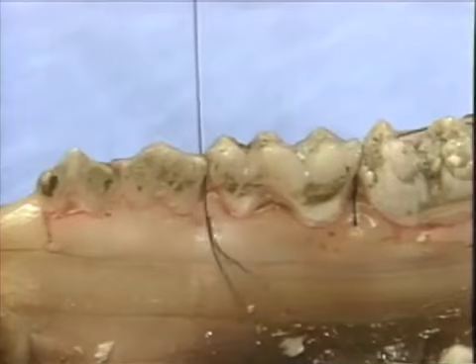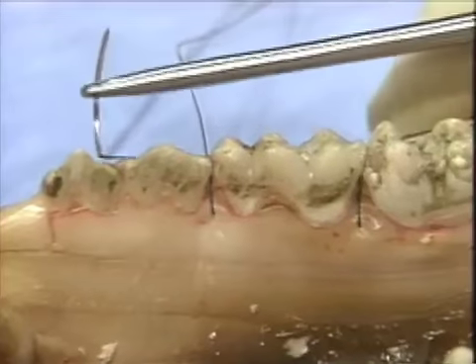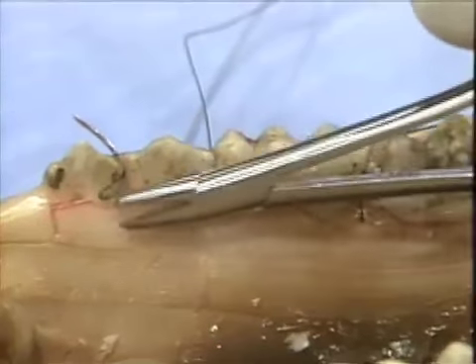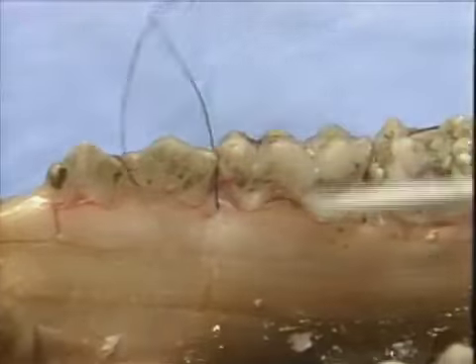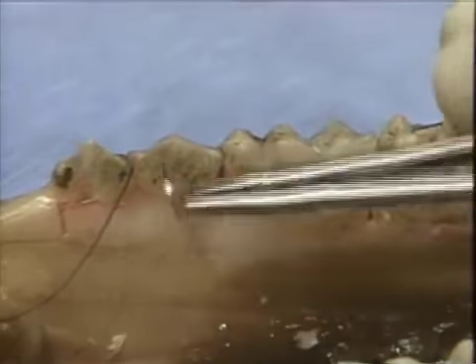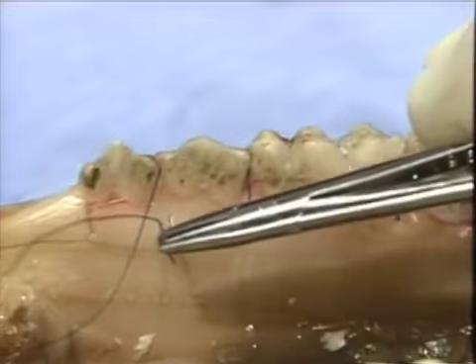Suture is passed back through the interproximal area and is slung around or along the buccal surface of the adjacent tooth. The procedure is repeated in anterior areas until the lingual flap is completely sutured from distal to mesial.